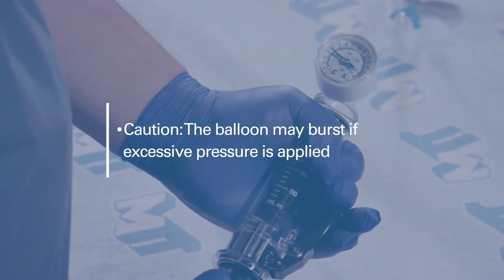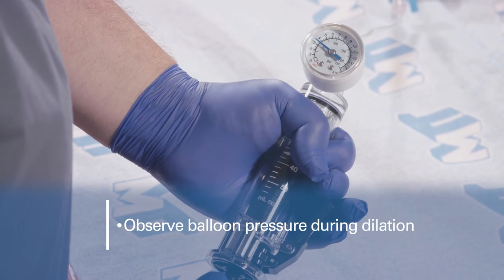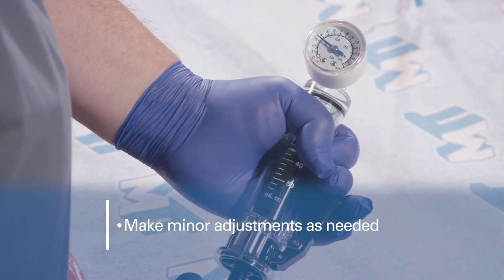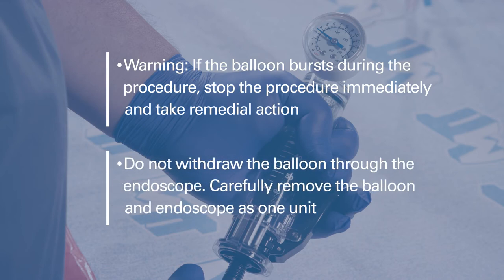Caution: the balloon may burst if excessive pressure is applied. Carefully observe the balloon pressure during dilation. It's normal to make minor adjustments to maintain the appropriate pressure. If the balloon bursts during the procedure, stop the procedure immediately and take remedial action. Do not withdraw the balloon through the endoscope. Carefully remove the burst balloon and endoscope together as a single unit.